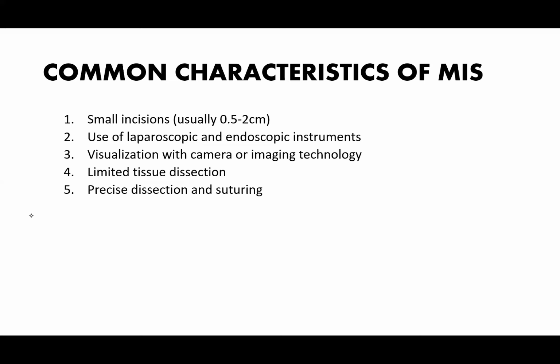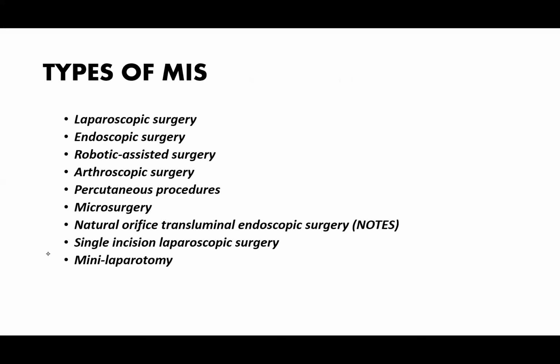Now, the common characteristics of minimal invasive surgery: small incisions that usually range from 0.5 to 2 centimeters, use of laparoscopic and endoscopic instruments, visualization with camera or imaging technology, limited tissue dissection, precise dissection, and suturing. Now, these are characteristics that are common to minimal invasive surgery.